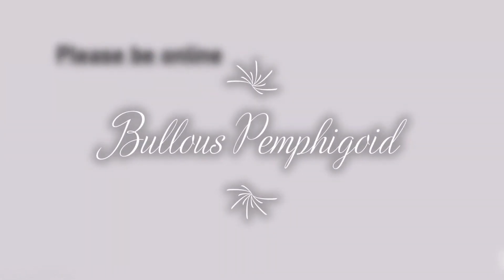Hello people. So today's class will be on Bullous pemphigoid. For such lesions we will receive a skin biopsy specimen which is very tiny, so the gross is not that remarkable, and we are directly given the slide.